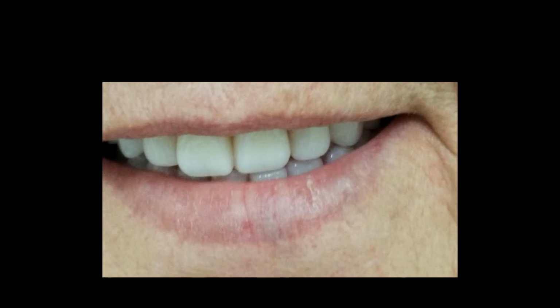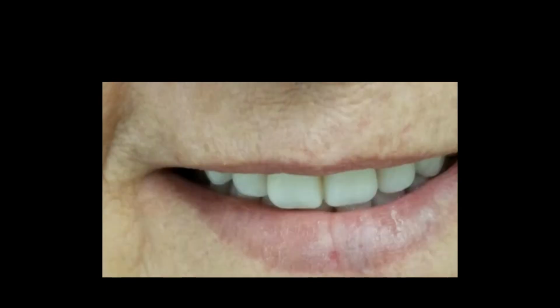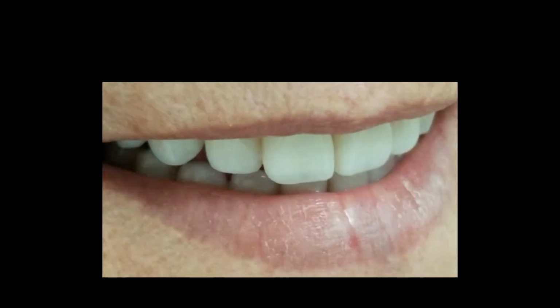And so it didn't come out straight. We look for protrusive on an articulator. We come straight out. Look, her protrusive didn't come straight out. And that's where you run into the trouble of teeth chipping and things that aren't working because we didn't set the teeth right. So I want to be clear here, and this is where Jim's going to stand up and do the hula: when you chip teeth and you chip anterior teeth, it is not the manufacturer's fault.